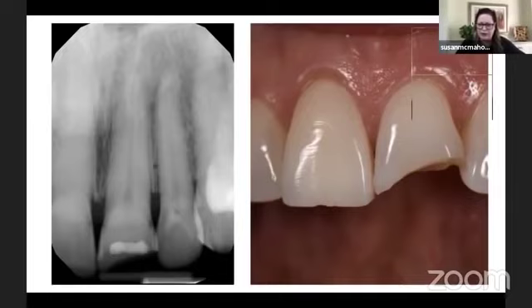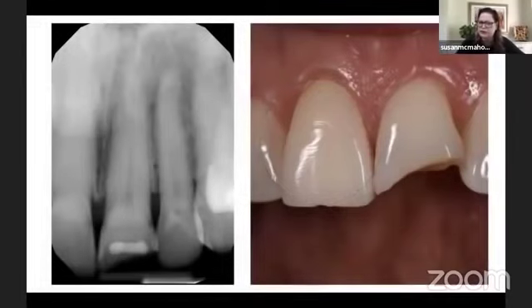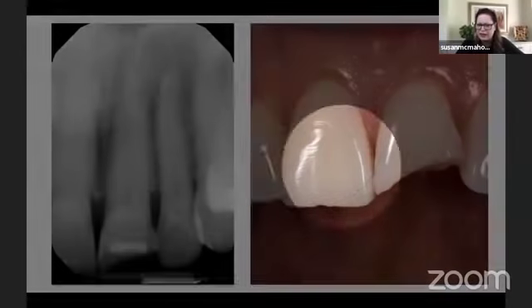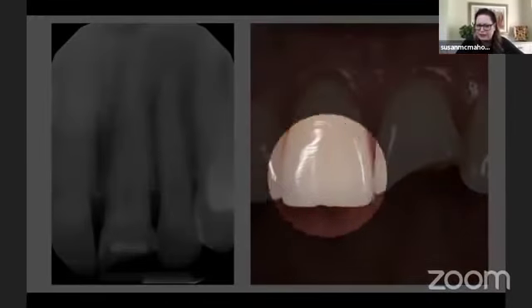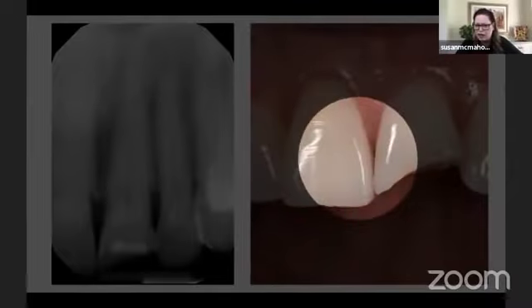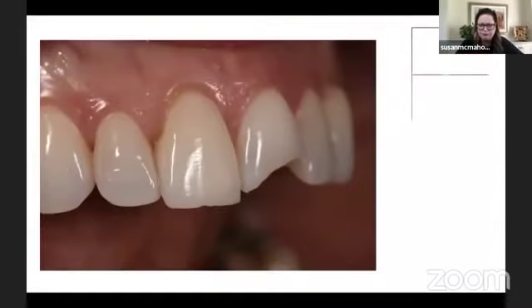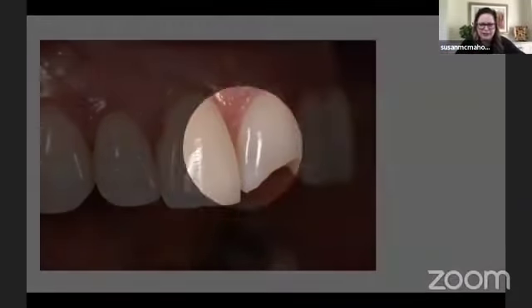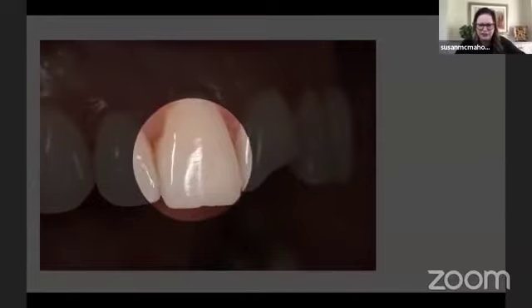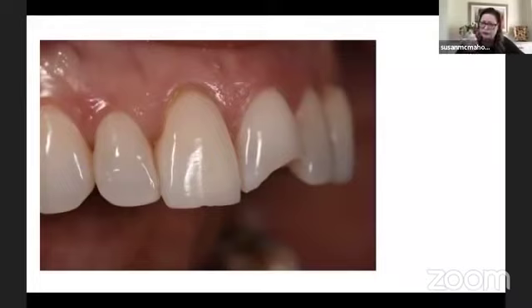But I want you to take note of her other central incisor. That one looks completely different than the one we just restored, right? It has really deep lines horizontally all through the facial surface, really strong line angles, and the lobes are not nearly as deep. Looking at it this way, you can see the same thing. You can really see that surface texture in there. We want to match that, so her restored tooth looks like her original tooth.